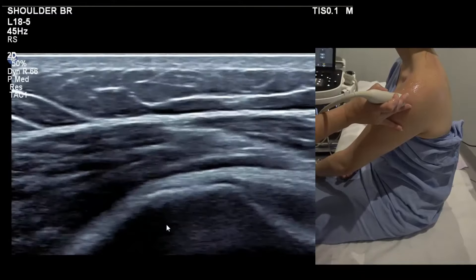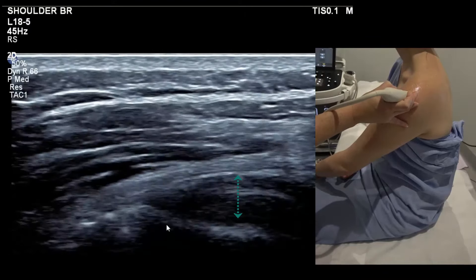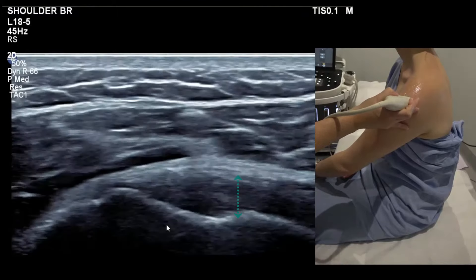If you go any higher from teres, you go straight back onto infraspinatus, but you can see that's a poor position for infra — it's not showing the fibres.